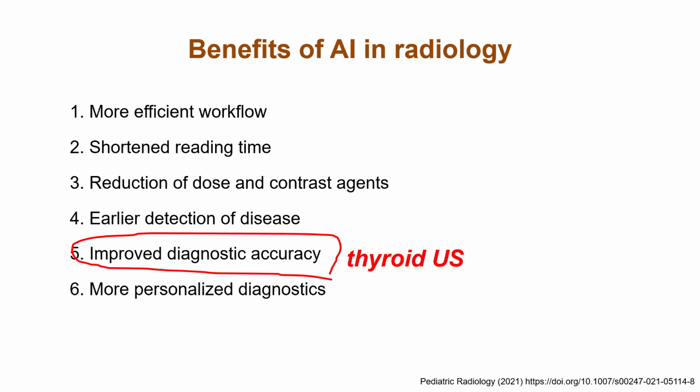Unlike its application in determining the severity of an illness while finding lesions in images like chest X-rays or mammographies, AI is solely utilized in thyroid ultrasound to classify benign and malignant lesions captured by the ultrasound performance.